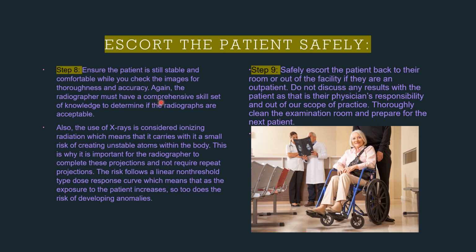Again, the radiographer must have a comprehensive skill set of knowledge to determine if the radiographs are acceptable. And then lastly, step number 9, safely escort the patient back to their room or out of the facility if they are an outpatient. Do not discuss any results with the patient, as that is their physician's responsibility and out of our scope of practice. Thoroughly clean the examination room and prepare for the next patient.